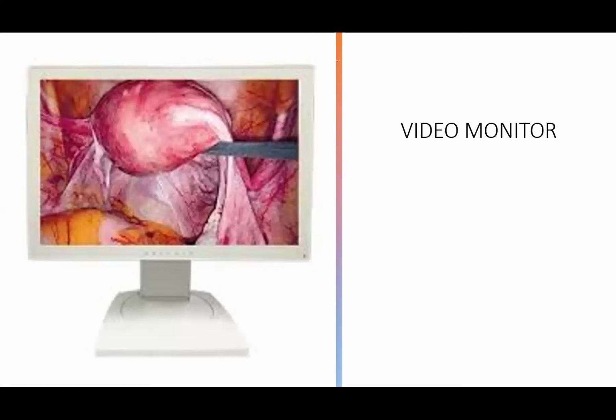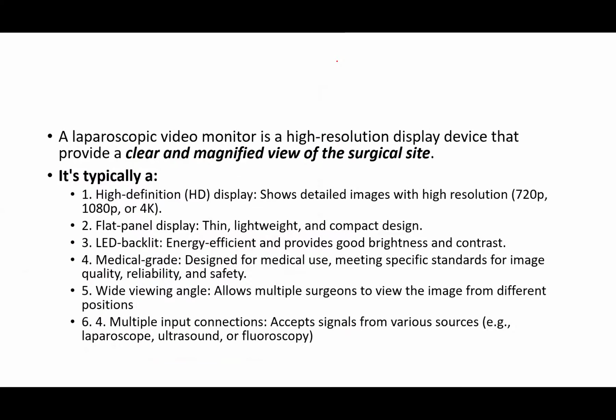The telescope is introduced into the cavity and picks up the image, okay? The telescope is connected to the camera head. It picks up the image, transmits it to the endovision camera that processes the image and sends it to the video monitor on the screen, which is now interpreted.